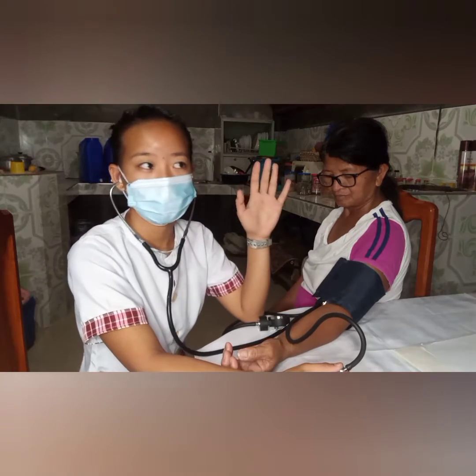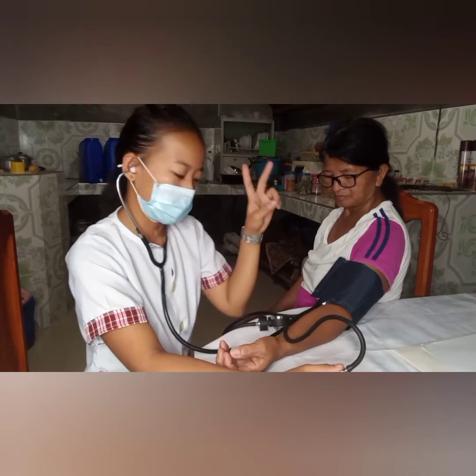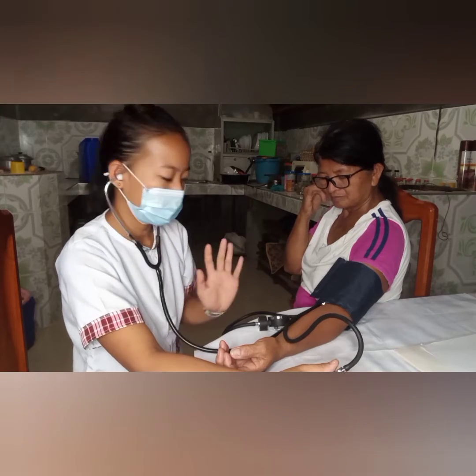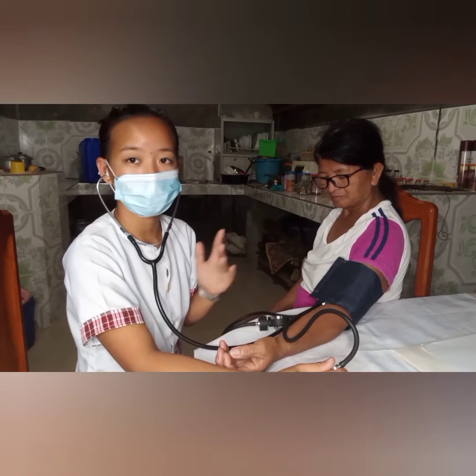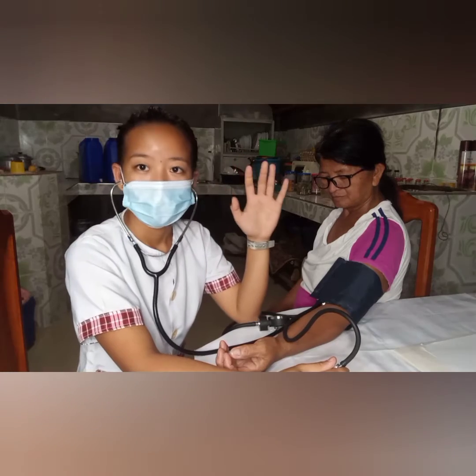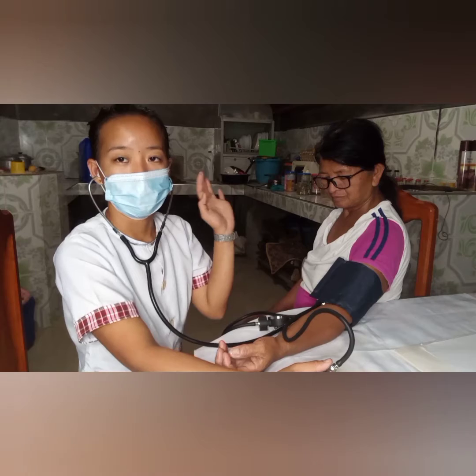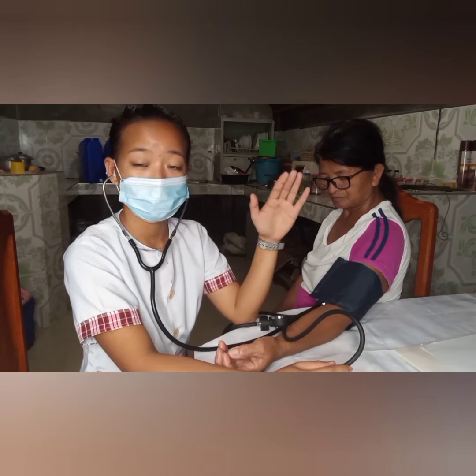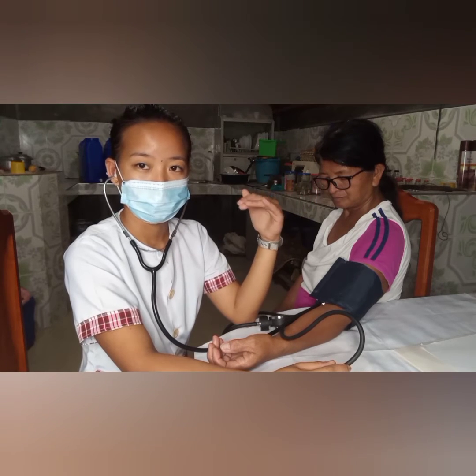With that, we can hear two sounds, which include the systolic and the diastolic. The first sound that I heard was at 110, and that is the systolic. And the second sound that I was able to hear was at 70. So the blood pressure of our patient is 110 over 70, which is just normal, since the normal systolic and diastolic is 120 over 80.